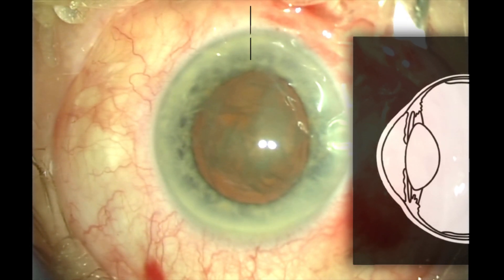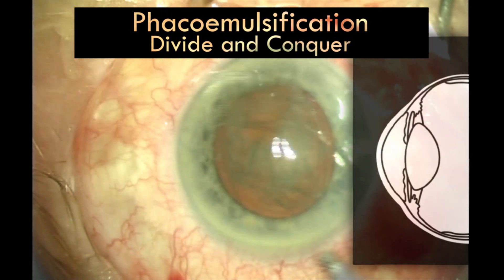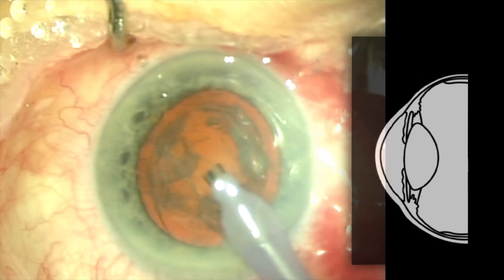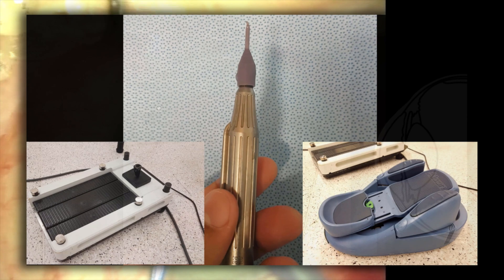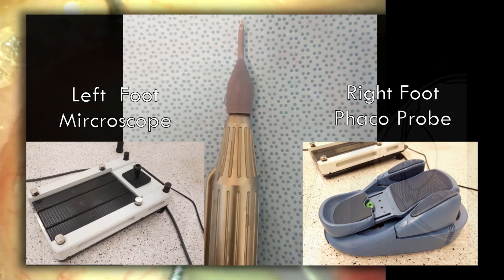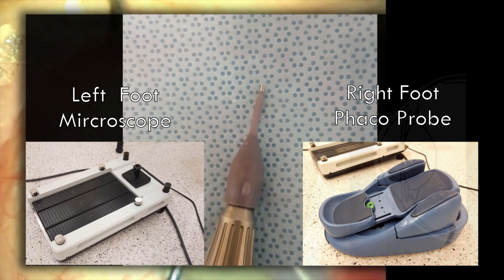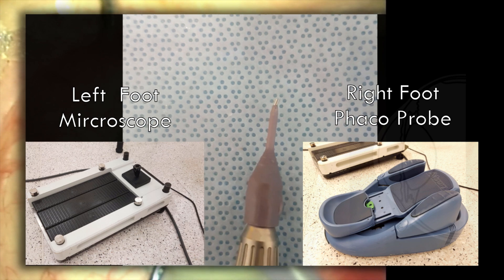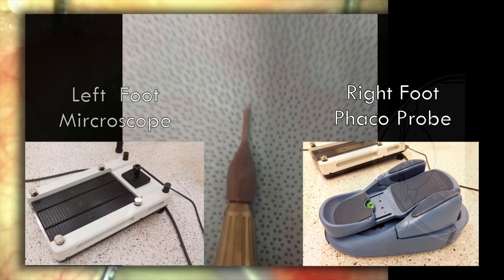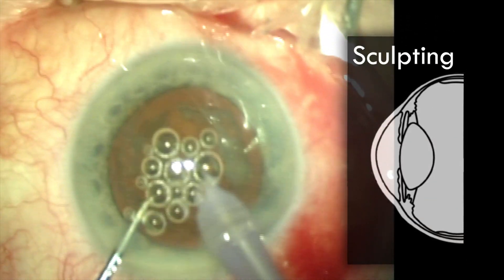Now we move on to phacoemulsification. This is where the cataract is broken down with ultrasonic energy and aspirated through a small probe. The handpiece is controlled with my right foot like a car pedal — I can control irrigation, aspiration, and phaco energy. With my left foot I'm controlling the microscope. The phaco probe consists of a hollow titanium needle with an enclosing cooling sheath. I'm holding the handpiece with my right hand and the second instrument, which is a chopper, in my left.